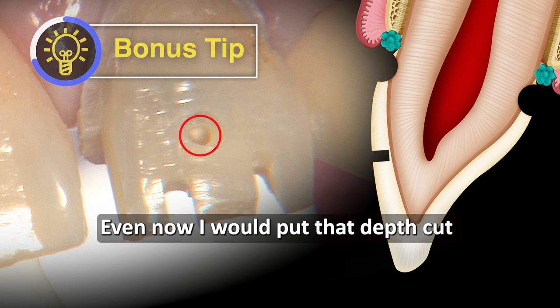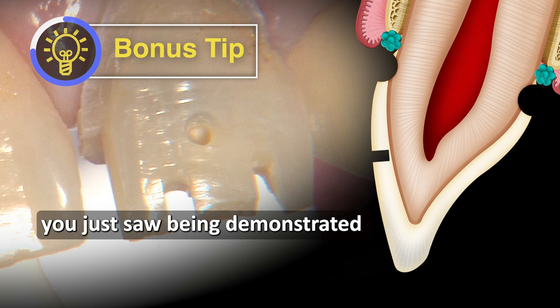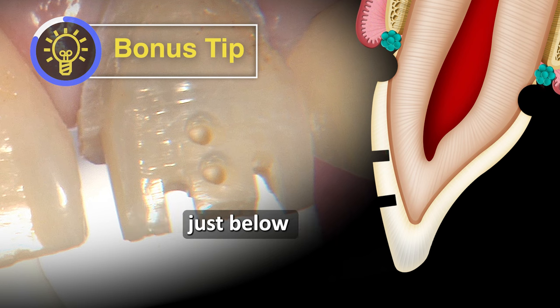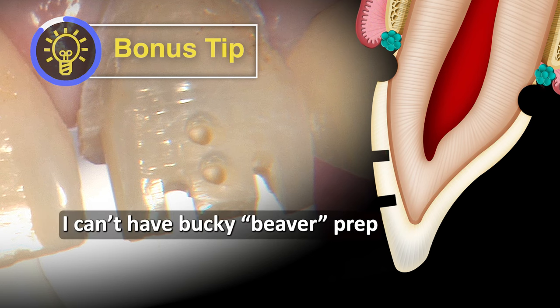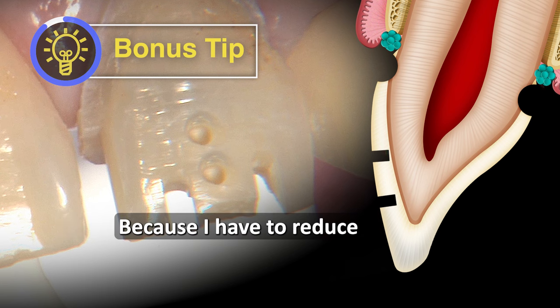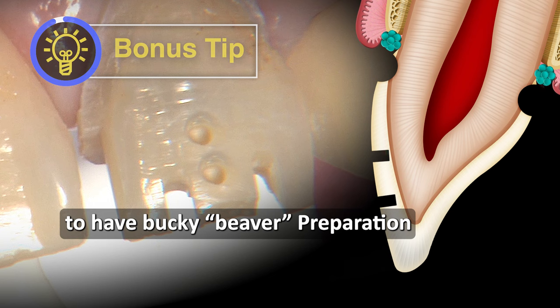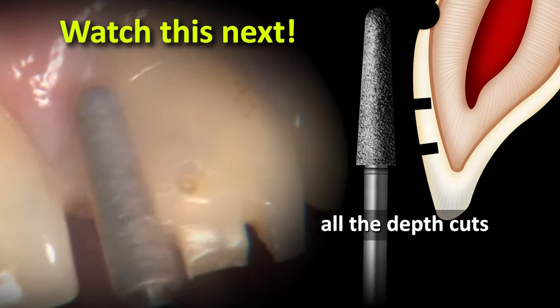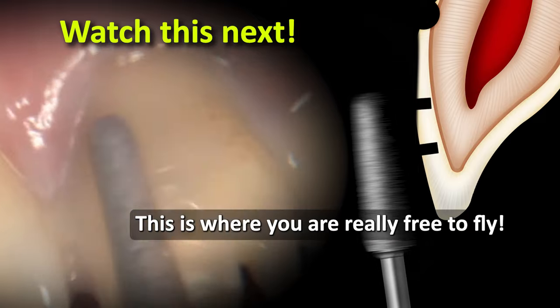Even now, I put that 1.5 millimeter axial depth cut a little bit closer to the incisal edge — literally just below where my incisal edge depth cuts are — just to make sure I can't have a bucky beaver prep, because I have to reduce down to where that depth cut is. It's impossible to have a bucky beaver prep when you put that depth cut right where it is. Now basically we've got all the depth cuts where they need to be, and it's just time to blend all of these. This is where you're really free to fly.